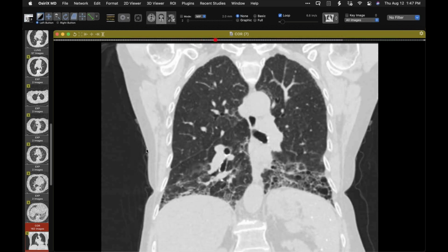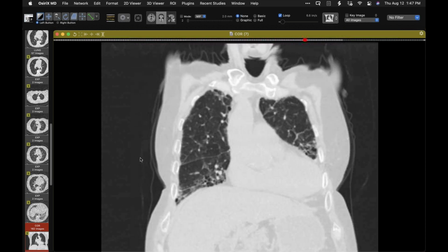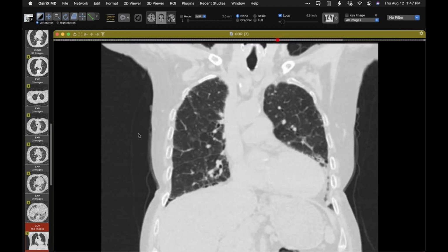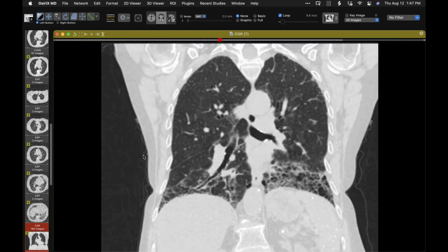I didn't get a chance to read the whole article, but it was really interesting. Yeah, we see a little bit of that here. I think some of my colleagues wrote that article. We call it lupus lung destruction. There's cystic change in the corners of the lungs.